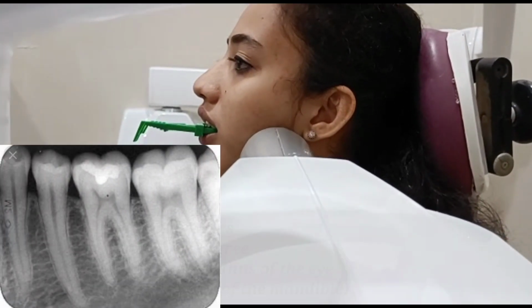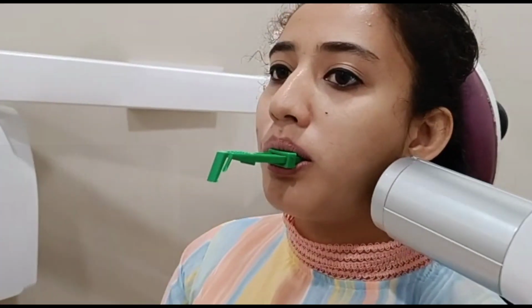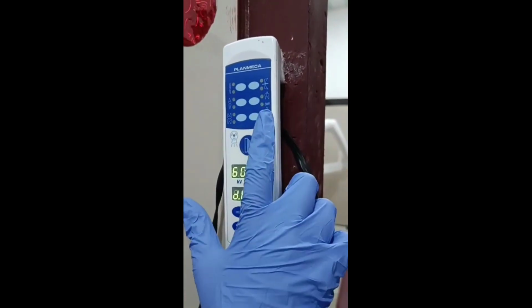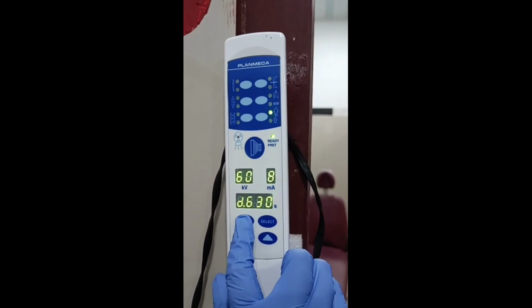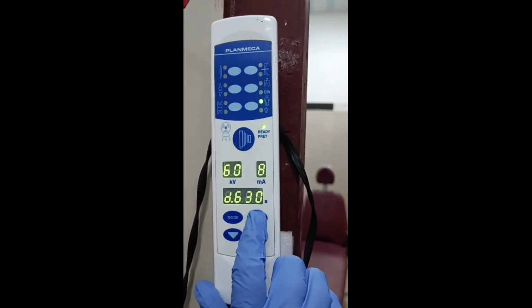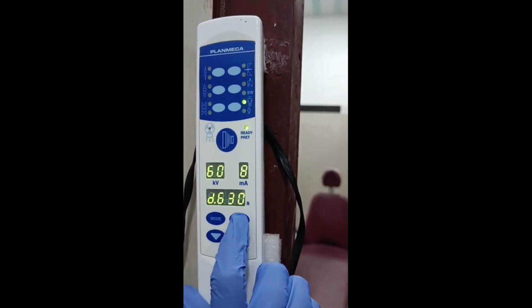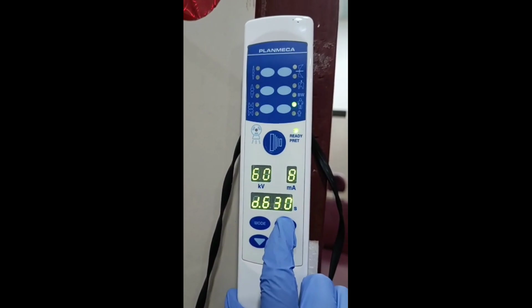Next, I'm going to show how we adjust the control panel. You can see that you can change the kVp, the milliamperage, and the seconds. It's given as 0.630 seconds as of now. This is how you adjust the kVp, the milliamperage, and the seconds.